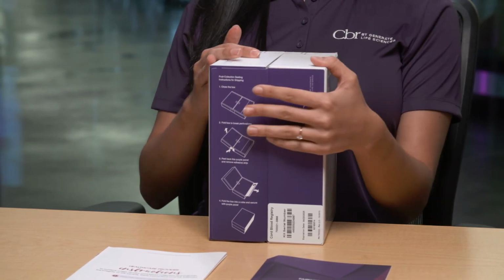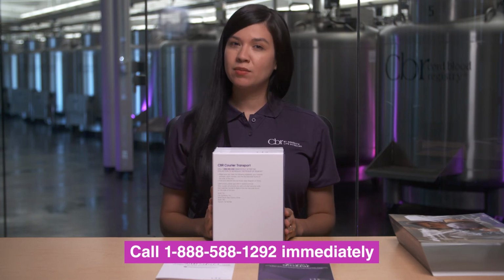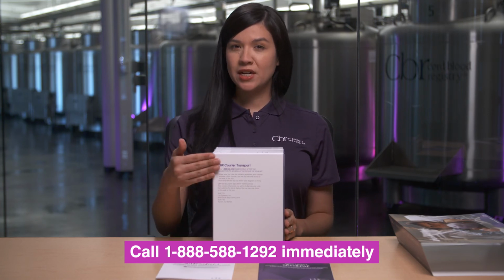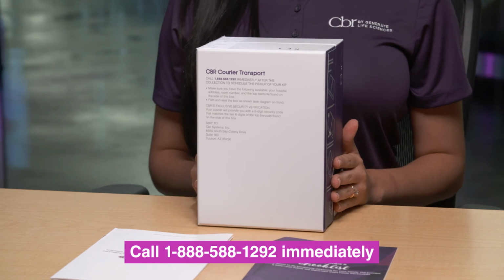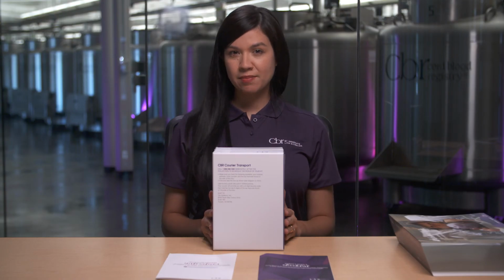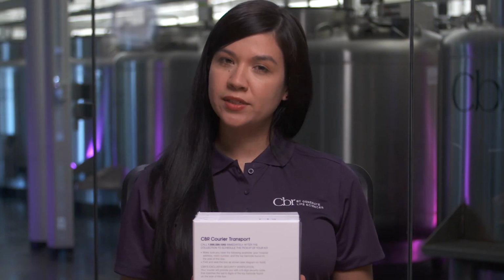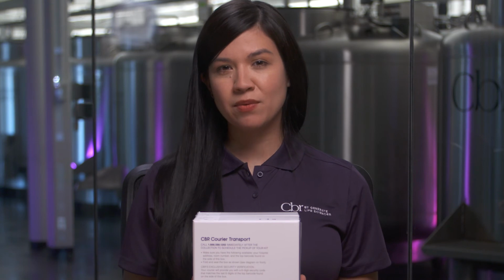Once this is done, you or your birthing partner need to call the medical courier, Quick International. They're available 24/7. Their number is located right here on the back of the kit. When you call, let them know that you have a CBR collection kit to be picked up, and they'll ask you for your room number. The courier should arrive within 4 hours. In the meantime, remember to keep it at room temperature.